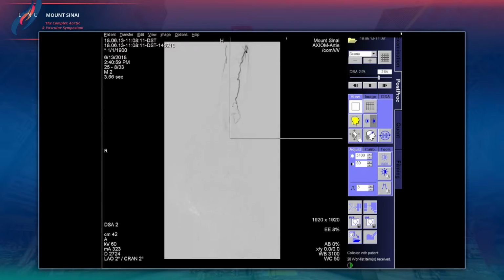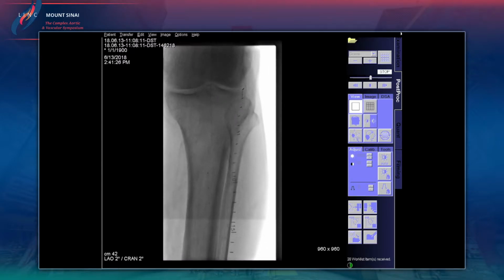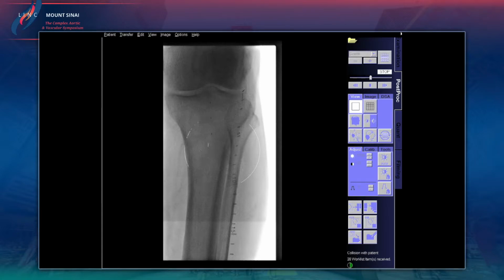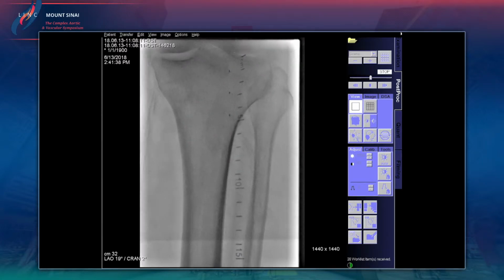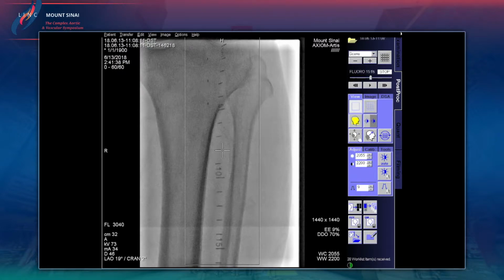So the question here is, in terms of therapy, it looks like he's had a proximal DES at some point. I'm just going to pull this back here and wire this, and I'm going to take a selective picture. Can I have now, what are the different wires you guys use to get through these subtotal, total lesions? Hydrophilic wire, guys?